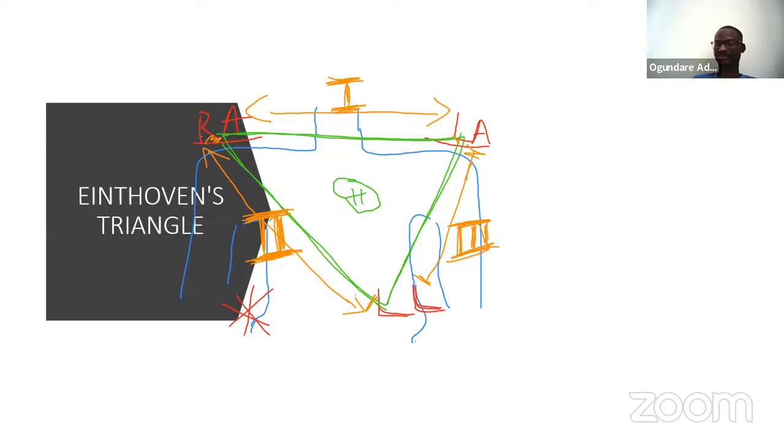That is simple enough. So this is how ECG leads are generated. Let me take you a bit ahead of time now.